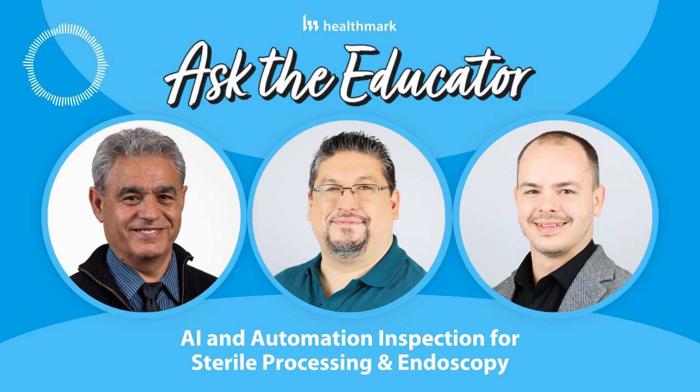I see that timing component being really important. And I also see the feedback. Say if I'm the one cleaning, I'm learning all the time whether or not my cleaning is effective. Or say I target education towards the operating room staff or procedural room staff to, hey, take it easier on that $30,000 piece of equipment that's in your hands all day.